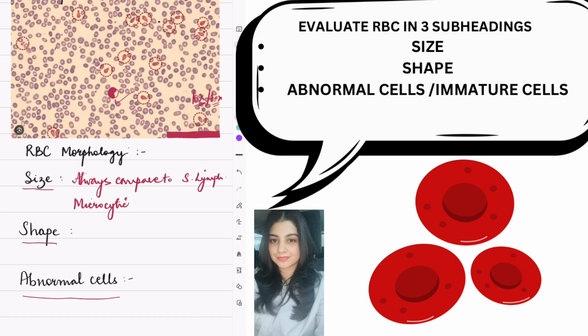Okay, now when it is microcytic, chances are that it will be hypochromic also. Now how will you deduce hypochromia? You will see the pallor inside the cell. Like a normal RBC would be this, just the central pallor. But as hemoglobin reduces, the white space inside the RBC increases.